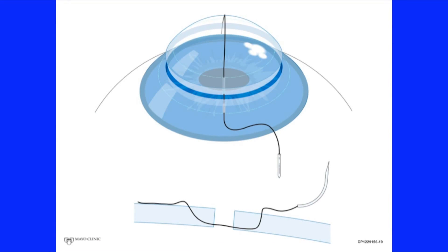As we pull this suture through the wound, we want the entire length of the suture to orient on the same plane as the suture that is passed through the cornea. We pull the needle side of the suture through on that line until the opposite end of the suture reaches the opposite corneal limbus. Then we cut the suture about four millimeters from where it exits the host cornea.